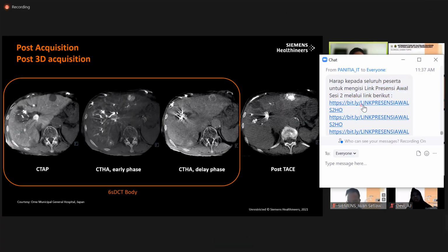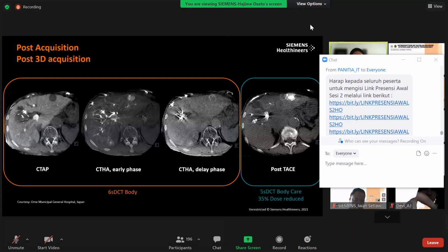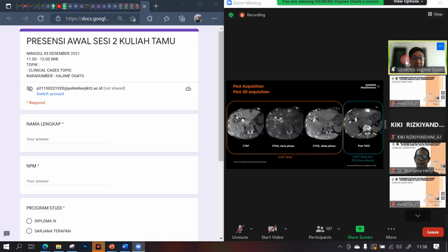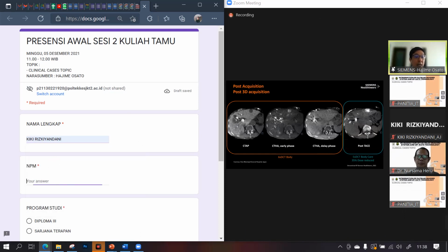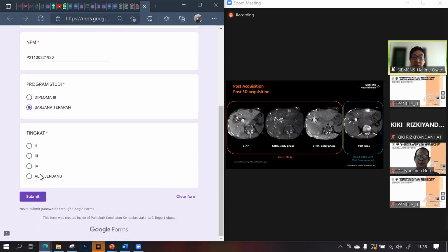On the other hand, for post 3D, we only confirm the embolic material. It has high density, so we can get enough visualization even if we use a low dose protocol. It makes a 35% dose reduction compared to the best protocol. You can notice noise on it.